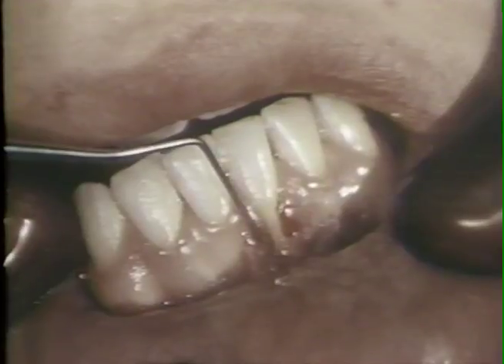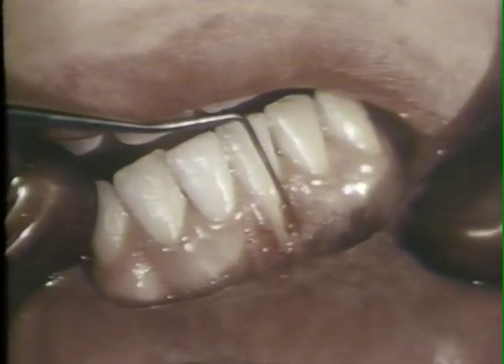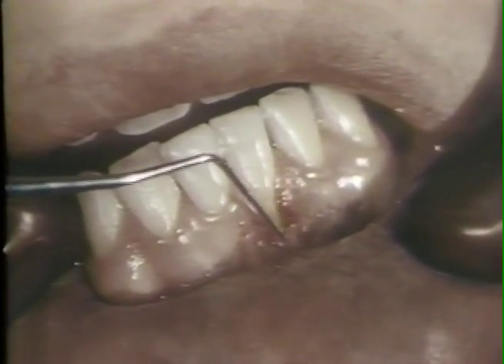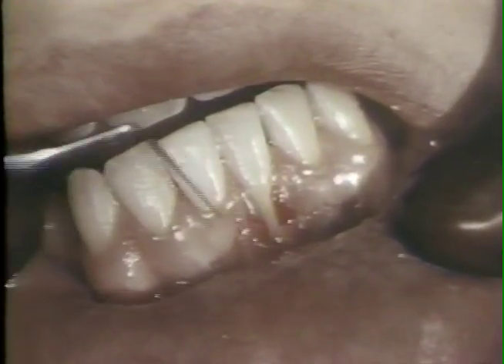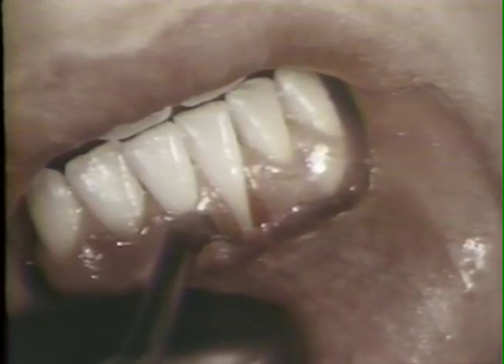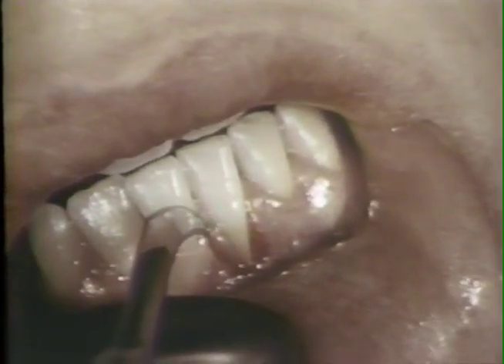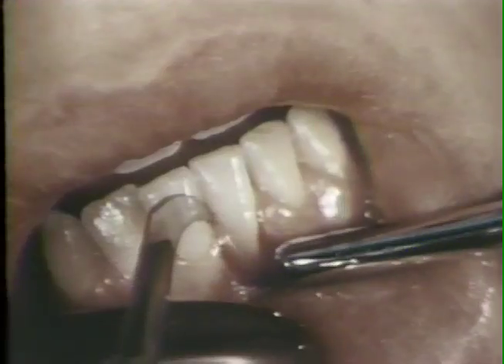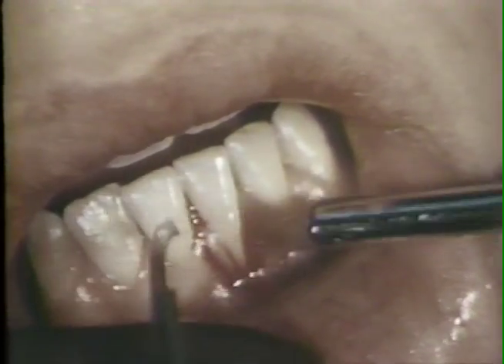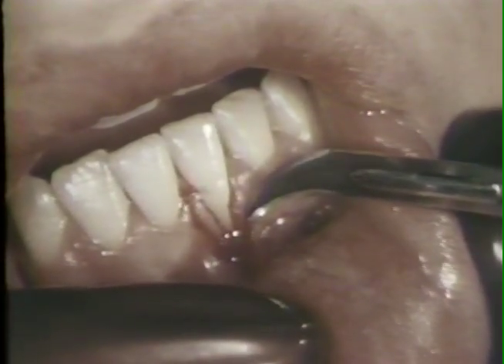A periodontal probe is used to outline the planned incision. The area has been anesthetized, and the mesial free gingival margin is excised with a barred Parker number 12B knife. An attempt is made to excise all of the free gingiva to the bottom of the gingival crevice. A similar incision is made for the distal side of the cleft.